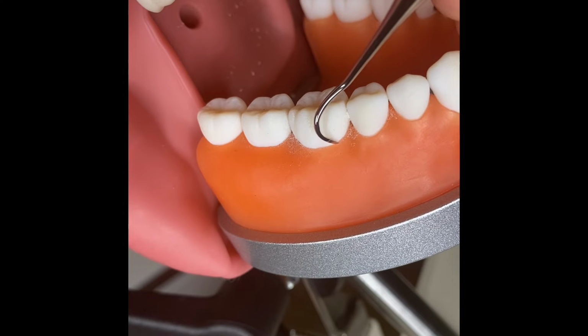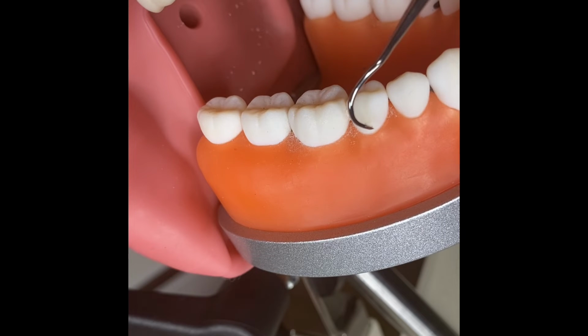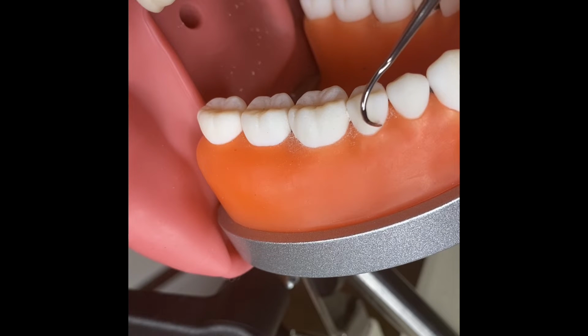I'm going at the mesiobuccal line angle, starting side to side, pivot, roll, side to side, pivot, roll, up, down, down.